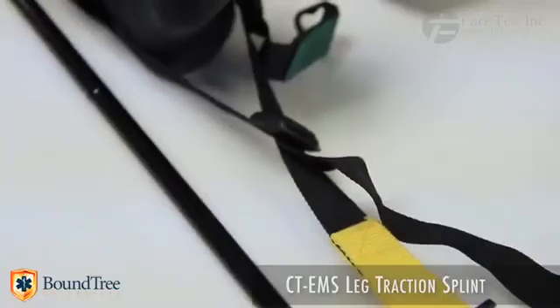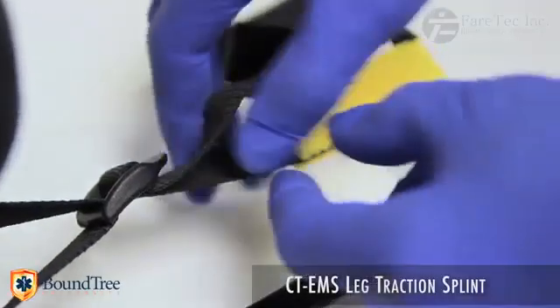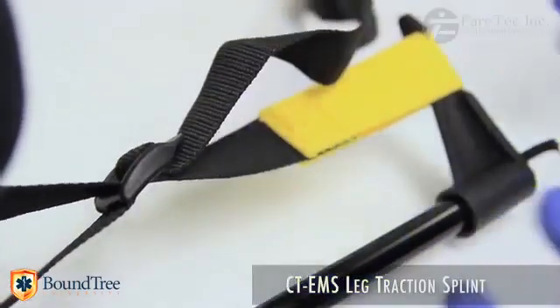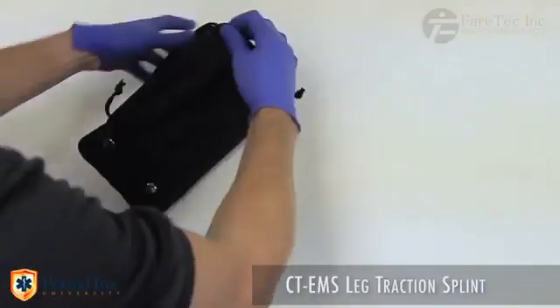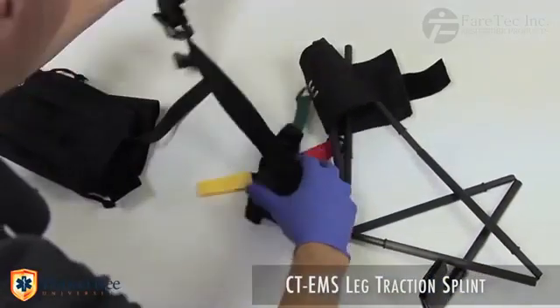Other splints on the market use nylon webbing pulled through a plastic buckle to achieve traction. Independent testing has proven this method to be ineffective. These same competitors also have their adjustment straps separate from the splint itself, which increases application time.